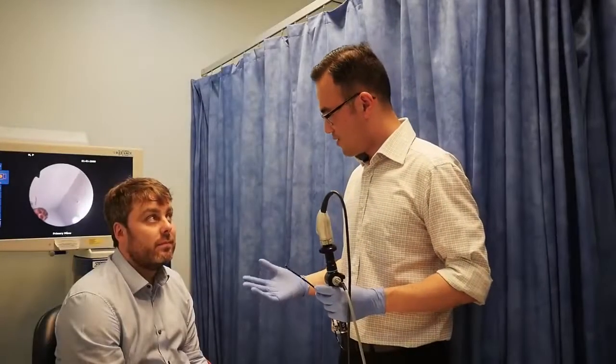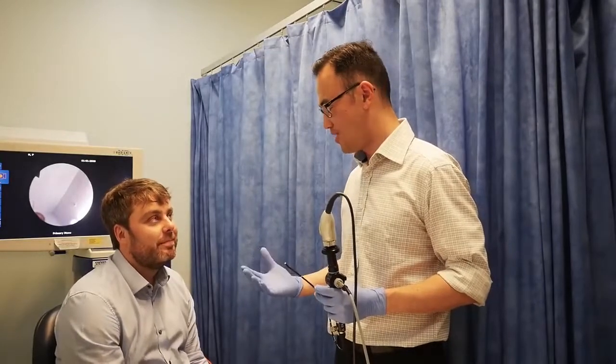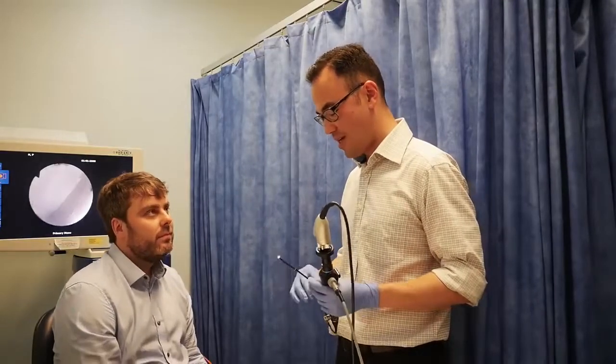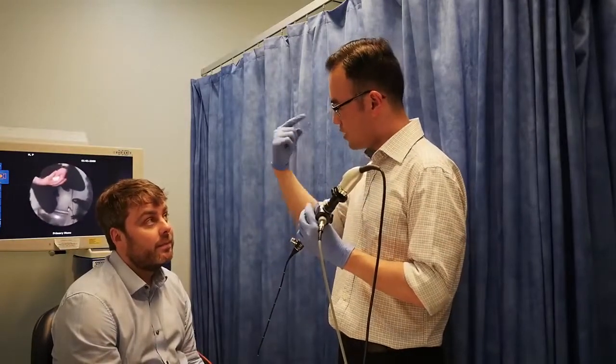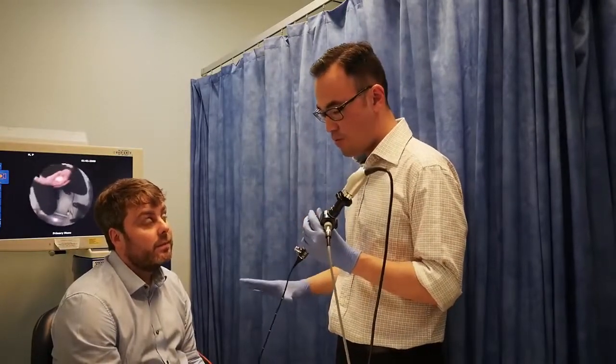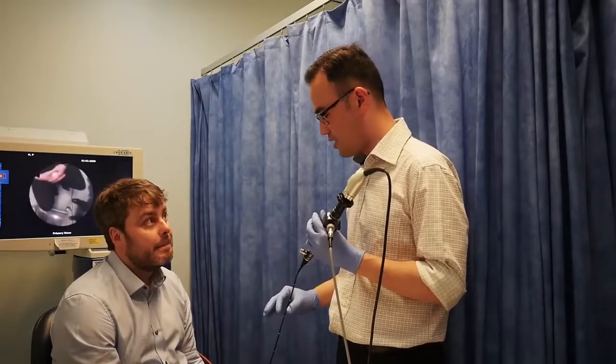Right, Phil, we're going to do a nasendoscopy today, all right? What I would normally tell the patient is I would normally say, I'm going to pass the scope into your nose, and it's going to run into your nose, down the back into your throat. The whole process should take about 2-3 minutes at the most. Sometimes we have to do it on both sides.